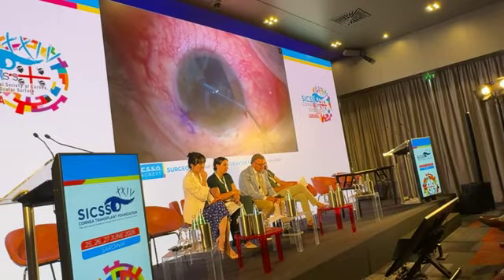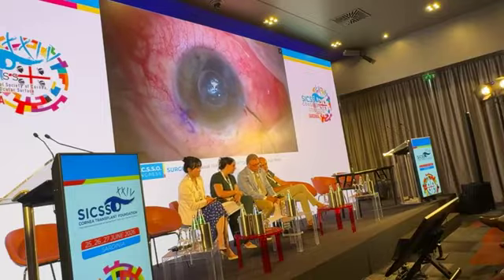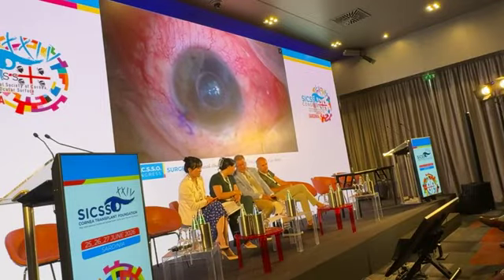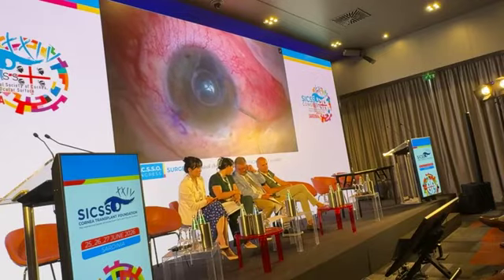So he's now going behind the graft. Oh, that is the main problem. Sometimes it happens, the graft actually shifts during the injection. Okay, he has injected the first bubble of air, and he has noticed that the graft has slightly shifted.